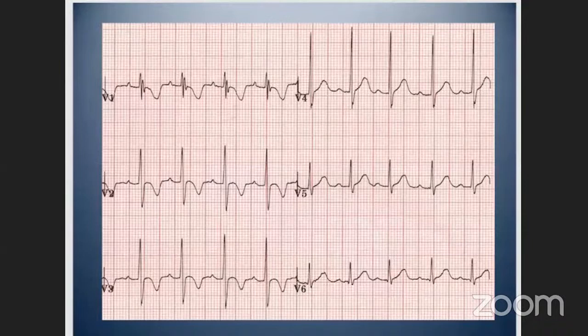Yes, Shiraz, thanks. So definitely, pulmonary disease pattern would be a foremost consideration. So in terms of your axis, right bundle branch block, strictly speaking, never causes a right axis deviation, but right ventricular strain, so in terms of acute PE or pulmonary hypertension, would cause, as we know, V4, V5, and 6 look more at the left ventricle. And then as Shiraz is pointing out, V1, V2, and V3 look more at your right ventricle. And so in the adult patient, this would be concerning for pulmonary strain.